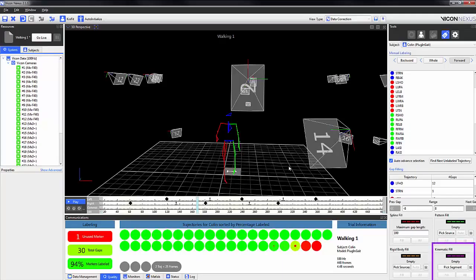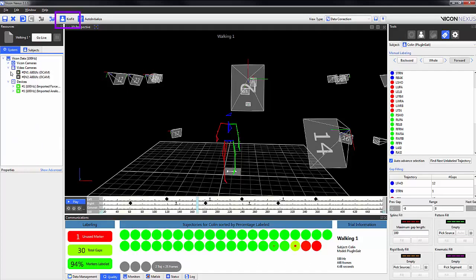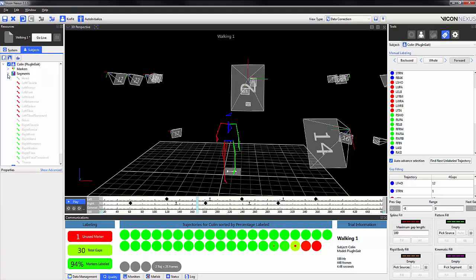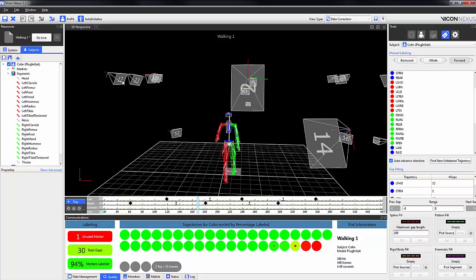The purple line is the kinematic fill. The kinematic fill uses the kinematics of the segment to fill the missing trajectory of a marker. In order to use the kinematic fill you first need to run the kinfit pipeline. In this case I'm going to use the kinematics of the right foot to fill the right toe gap.